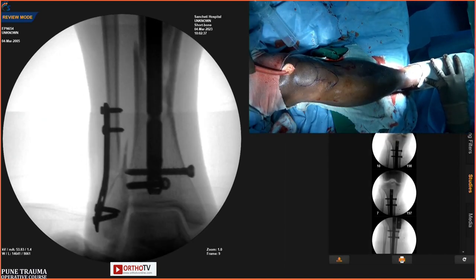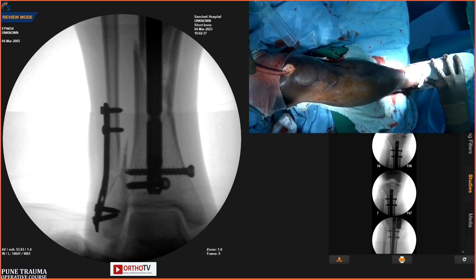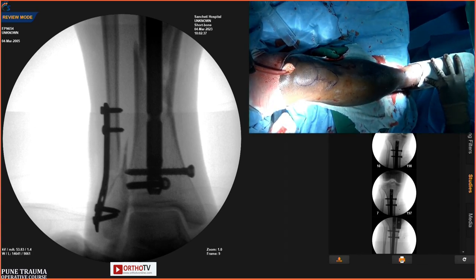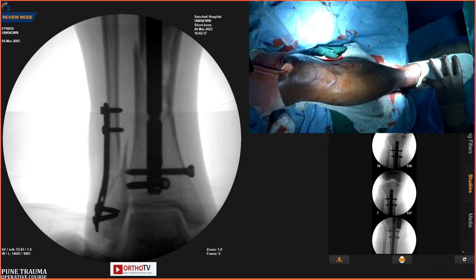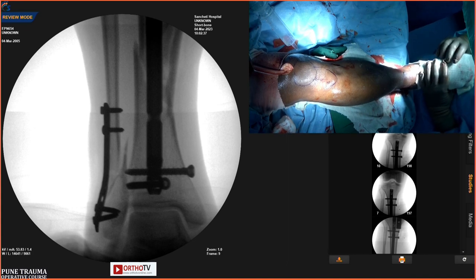Forget about those comminuted pieces. Everything will heal around the nail because we have stabilized the fracture by 3 screws, and probably we may add one polar screw if it is required. But in this case, the fracture is about 5 centimeters from the plafond, so it does not require any polar screw.